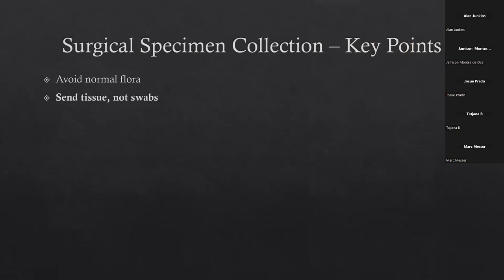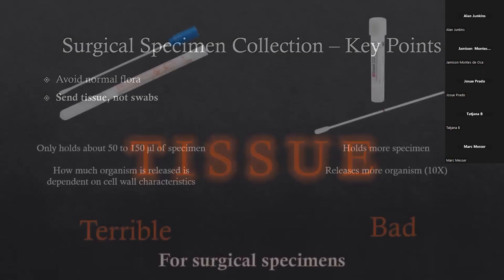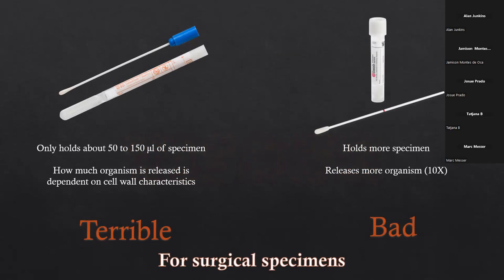Here's the biggie — and micro labs all over the country and world will complain about this. What we want is tissue. If you're going to go in to collect tissue during surgery, we want the tissue. We do not want a swab of the tissue. We want a specimen, not a swab of a specimen. Tissue is what we want to get.